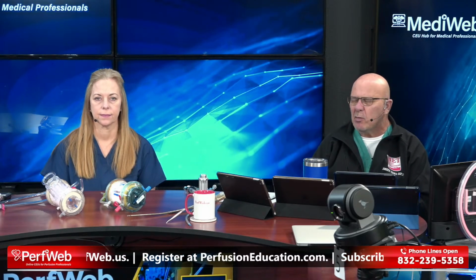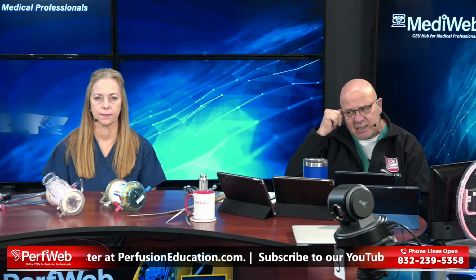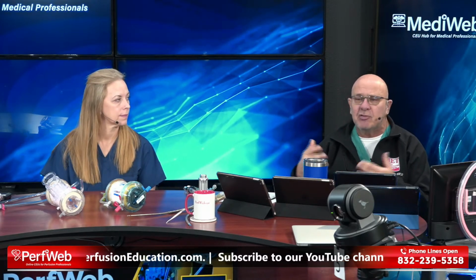We're also going to be showing you our ECMO platform. This is the actual ECMO circuit that we use routinely. It is the LivaNova SCPC. We're very happy with it. I know that they have discontinued manufacturing of the SCPC trolley platform, although it is our preferred.